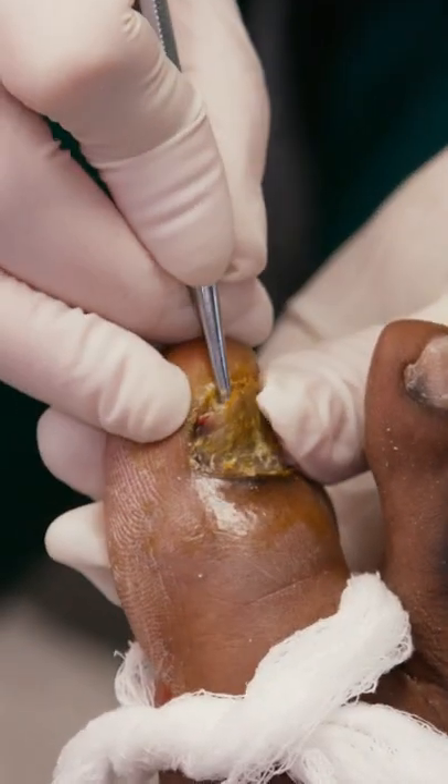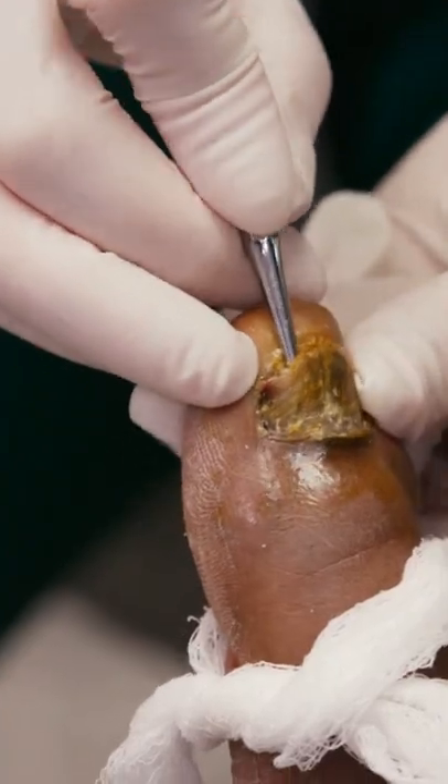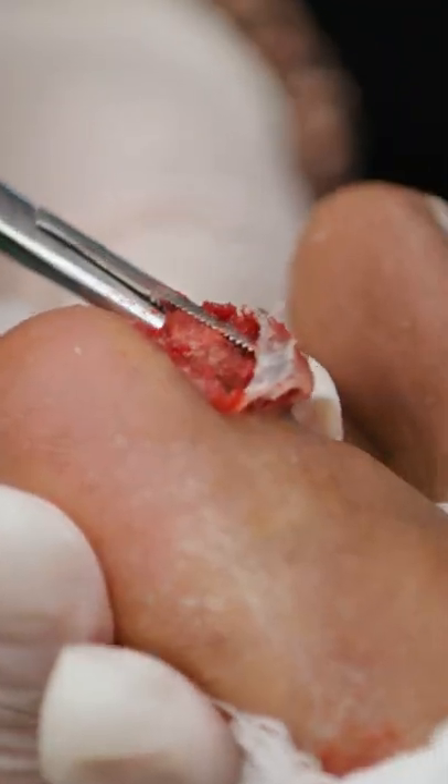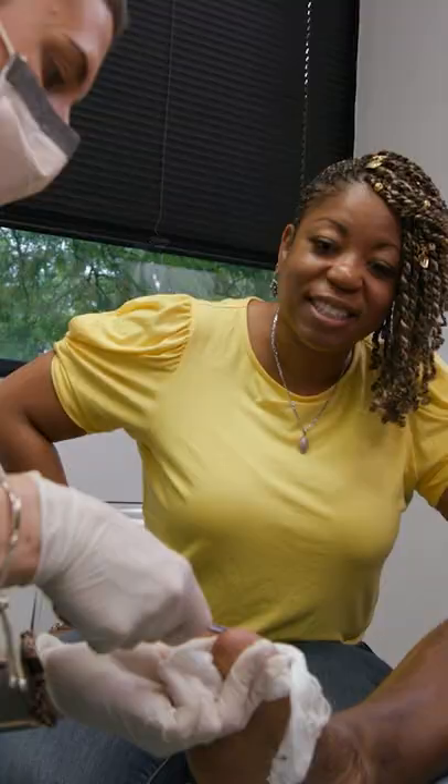There it goes. You can kind of feel it. You can see where I am at the bottom of this thing over here — you can see where my instrument is, how deep it is. It comes off in one fell swoop. It's kind of like pulling back a tuna can — you're just twisting it and it comes right off. It was a beautiful experience.